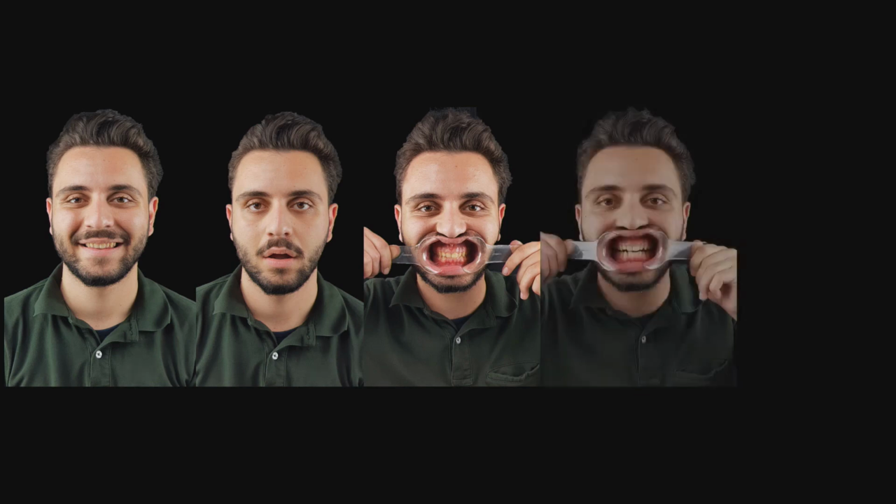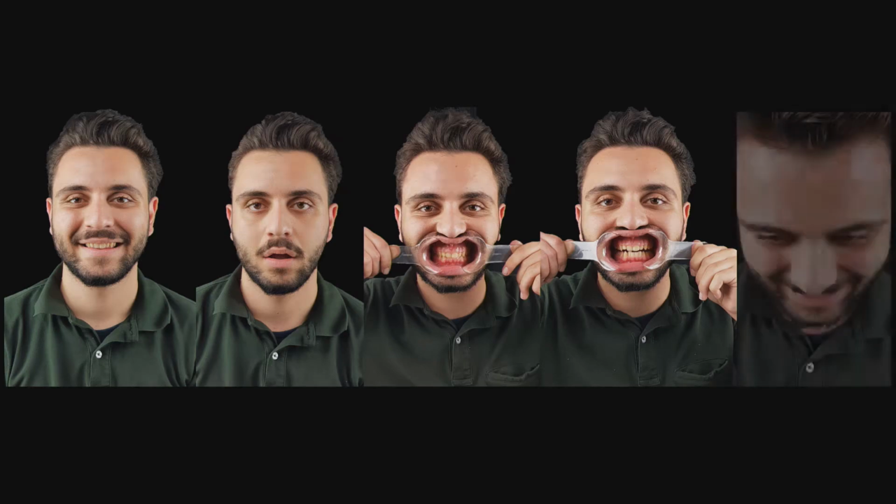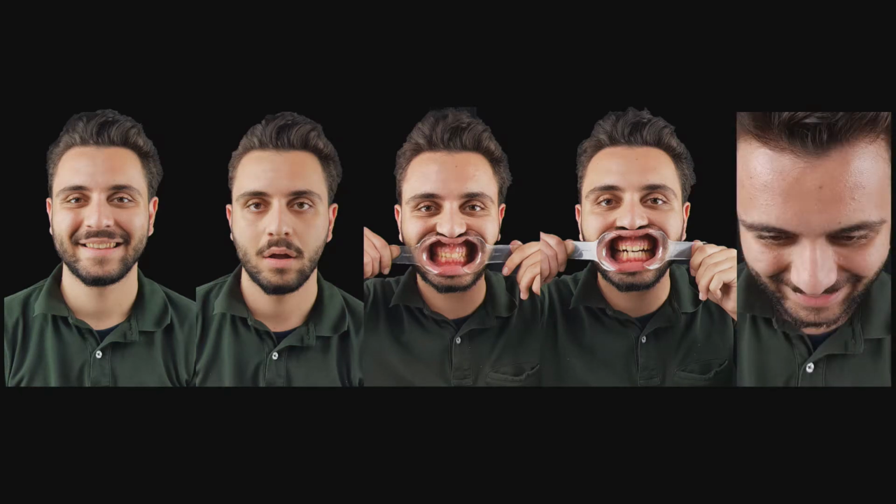The third picture is retracted lips in central occlusion. The fourth one is retracted lips with open bite. And the last one is the 12 o'clock picture. This way you can see the vestibulolingual position of the teeth and the width of the teeth.